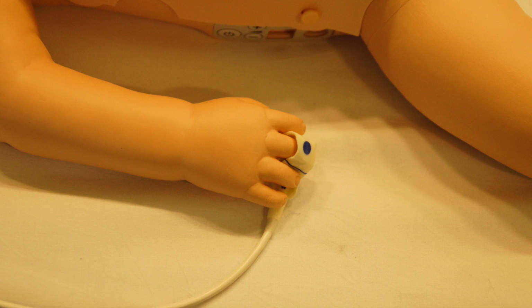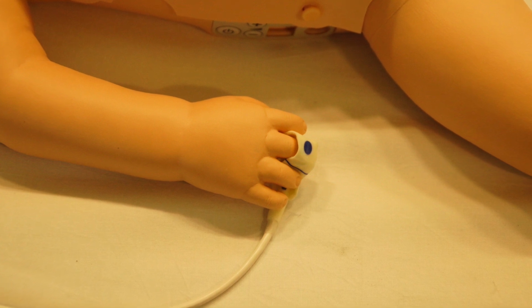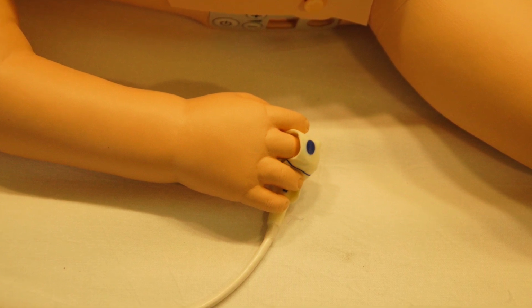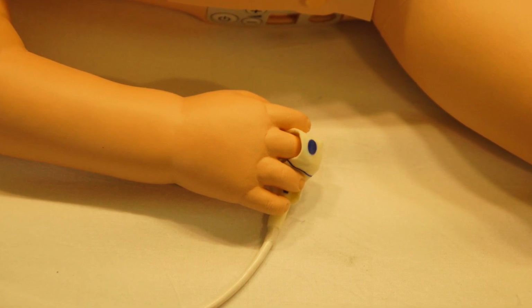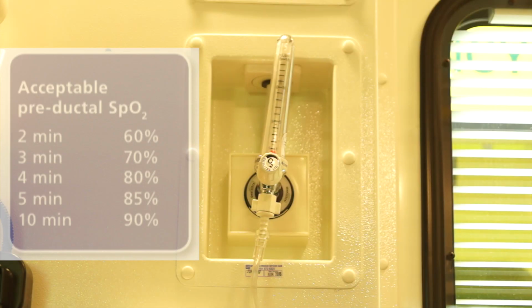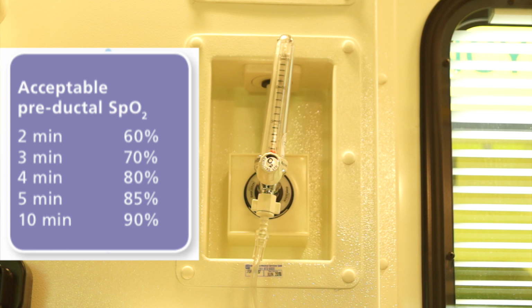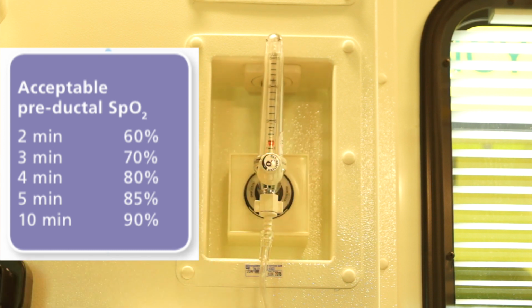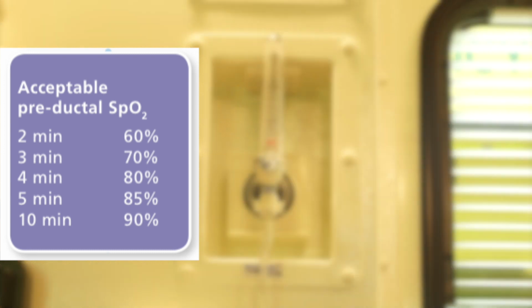After 30 seconds of ventilations and commencement of 3:1 resuscitation, consider preductal SpO2 readings by placing the sensor on a finger of the right hand. In order to achieve target saturations, introduce low flow oxygen and reassess at timed intervals as per the algorithm.